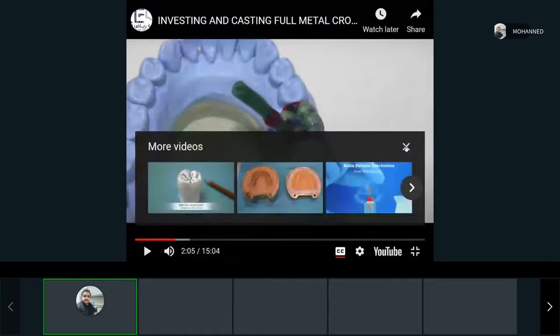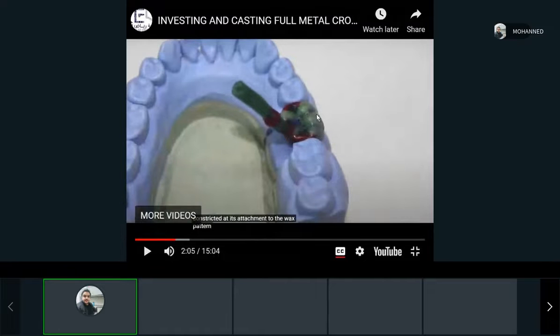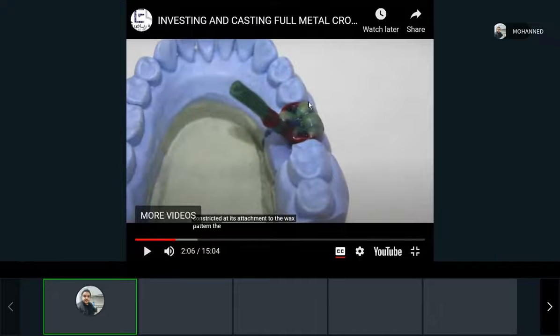They made the wax part. They made the crown out of wax, right? They build it up all together, and then you can see they put something which we call a sprue, and you'll see why this is placed in there. Technically, all of this that you're looking at is wax again. So we took the impression, sent it to the lab. The lab technician made a wax version of the tooth.